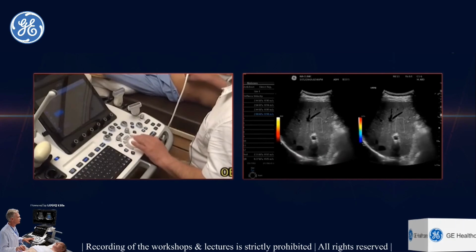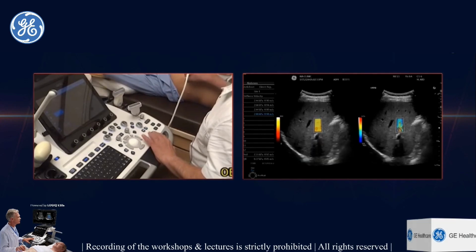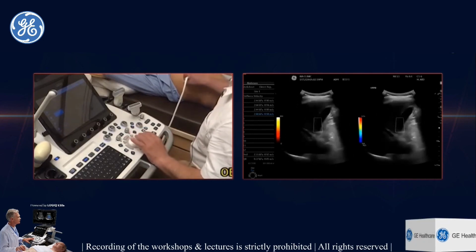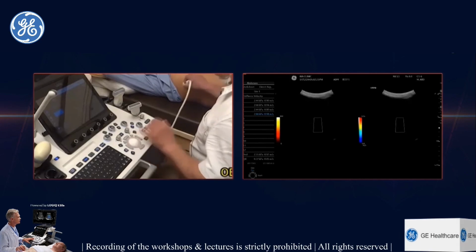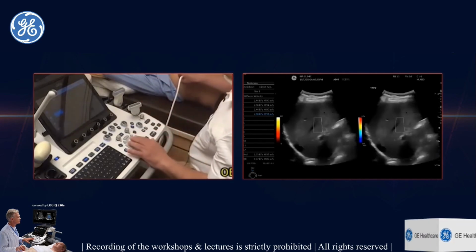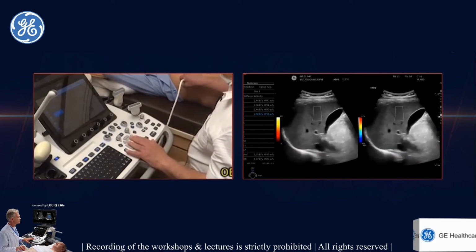So let's take this area now. Here again, we are having some vascular pulsations being transmitted. So we'll take another area again. So this improves the specificity of the technique. And in the past, wherever I used to get varying results, this was the reason.